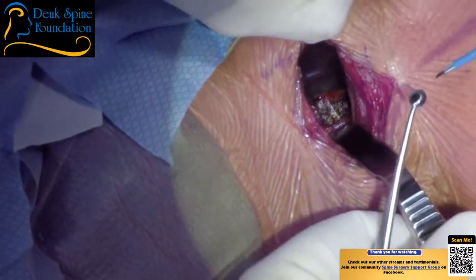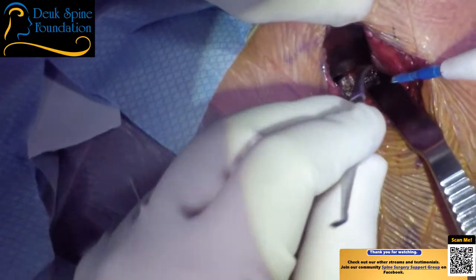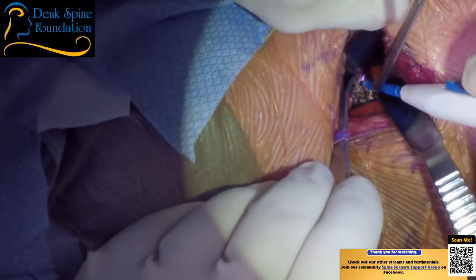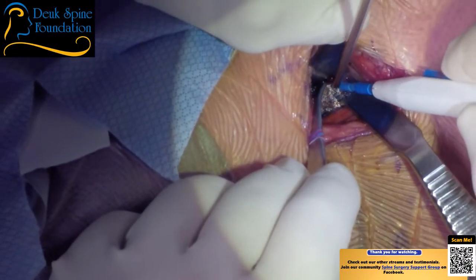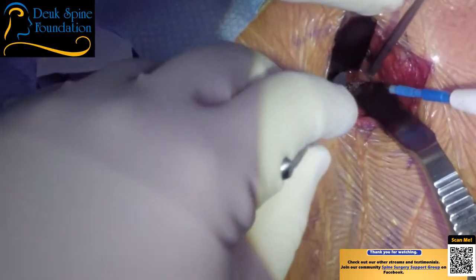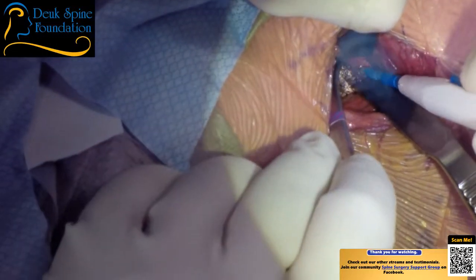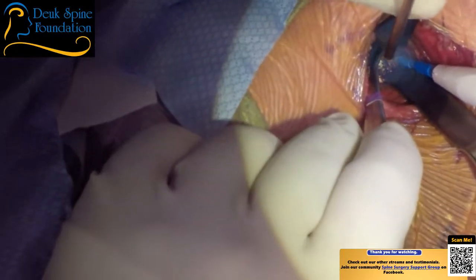Hold this here. Okay, you keep moving, Luis. Feel the bottom and hold it there. Okay, let me see. Good. Suck. Good. All right, Luis, right here. Good. Dr. Patel, I need to see down south. Yep, perfect. Just keep it there. Don't move. Nobody move. Luis, don't move. Dr. Patel, I need you to suck those fumes, or I can't see.